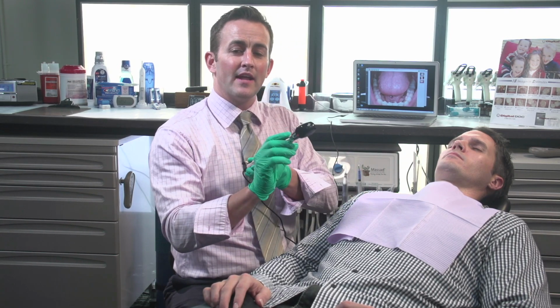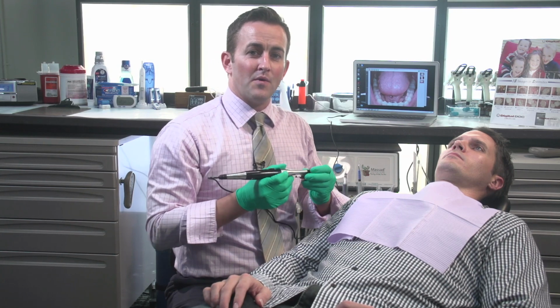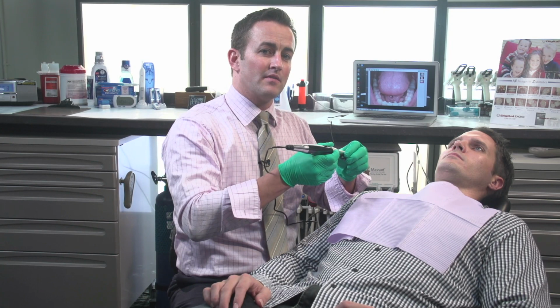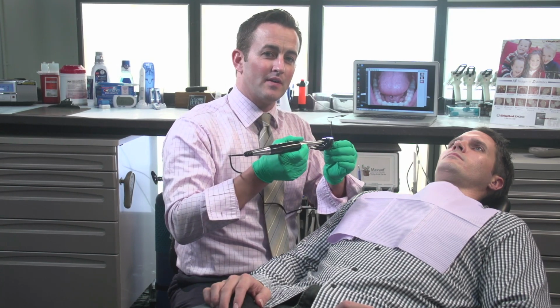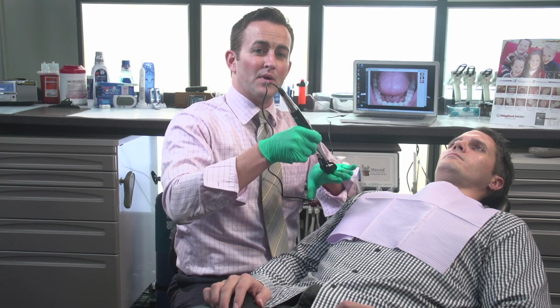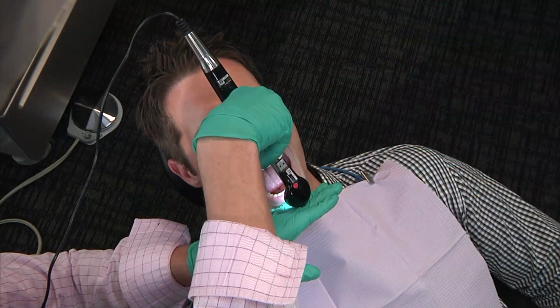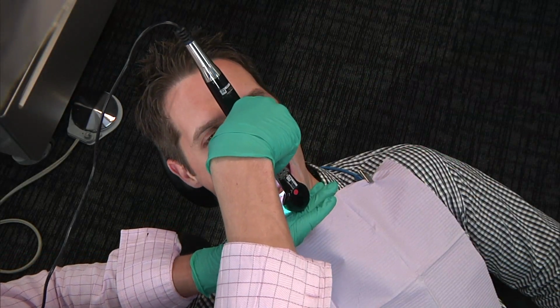Now the upper arch is a little different. We're going to keep your hand firmly placed on that labiomental groove, but simply adjust the camera in your hand like a pencil with your index over the capture button, and we're going to flip the camera upside down by placing the tip of the camera in the middle of the opposing hand. Now we're going to start off by breaking the midline, touching their nose, and then simply pull back.